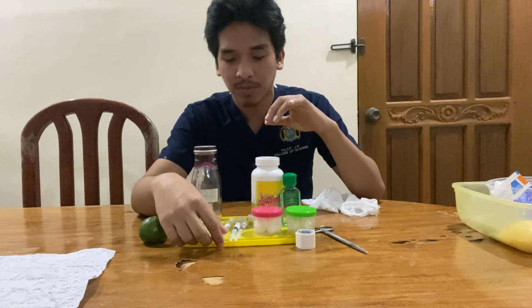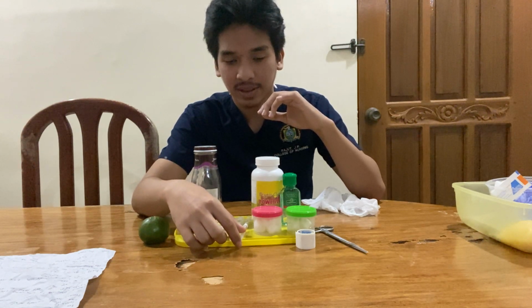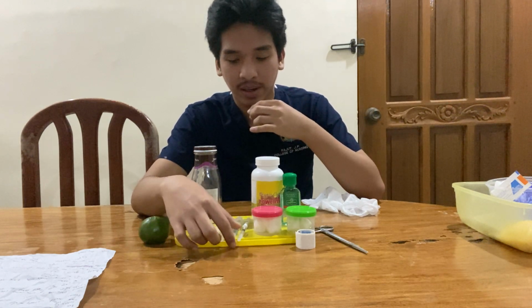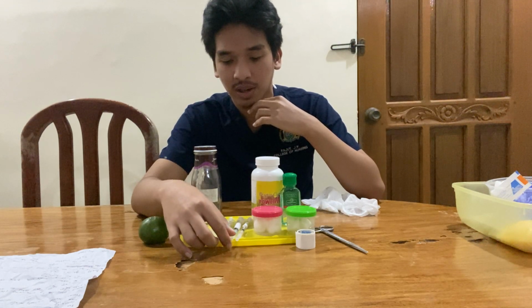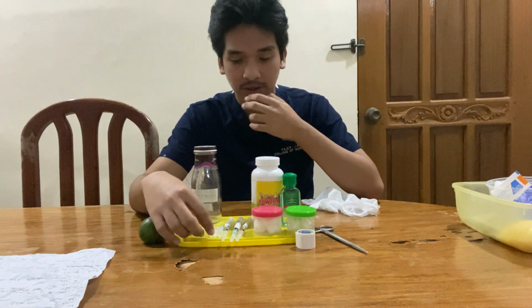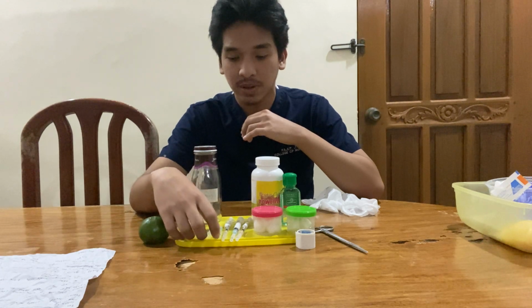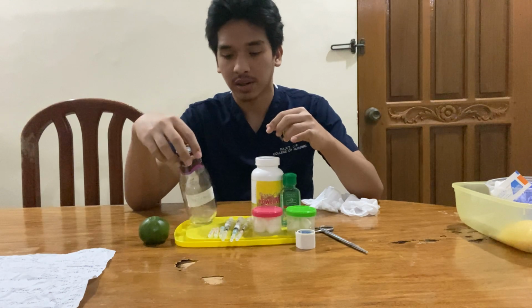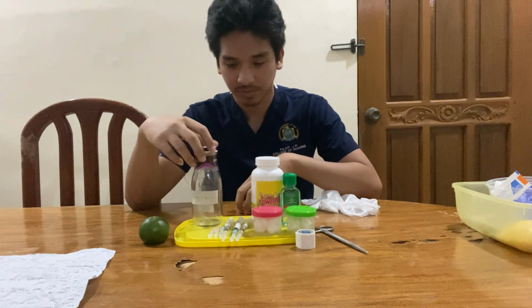Tuberculin will be used for the subcutaneous injection and the skin test, and then my 3 cc syringe will be used for the intramuscular injection. I also have 3 spare needles. This will be used for getting the medicine from the vial.